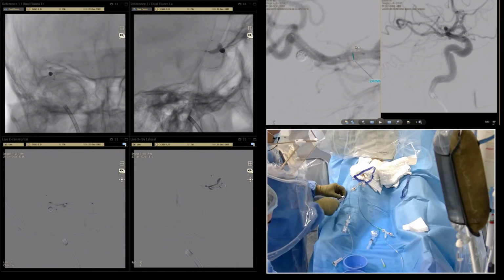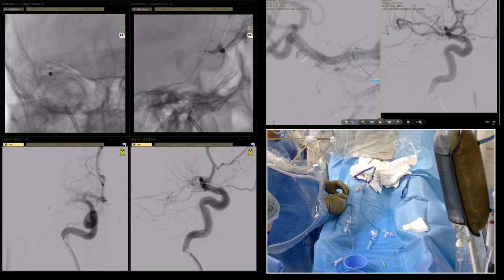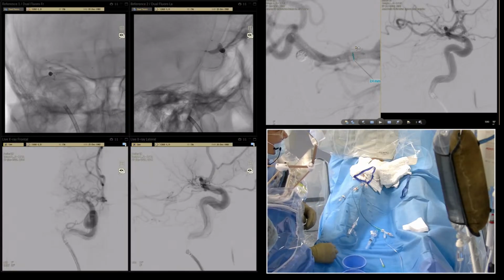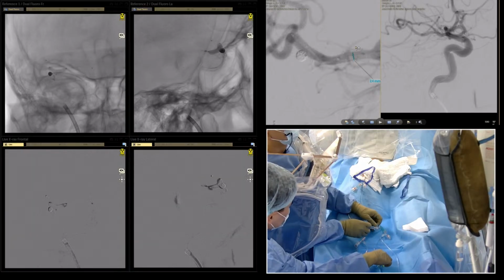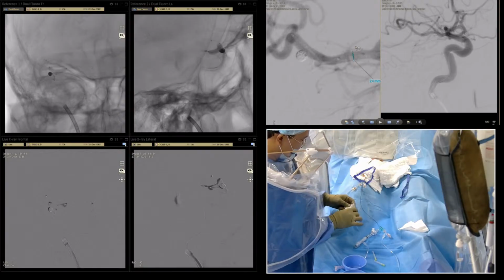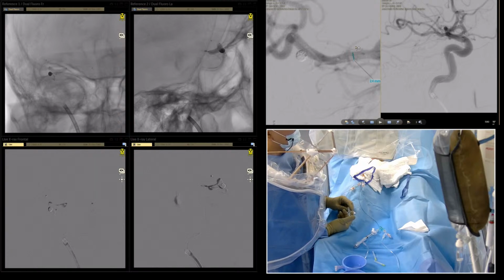I'm really scared to do angiography from the microcatheter. We can enlarge the hole. Okay, it's just at the point of bleeding. Okay, let's inject the liquid embolic. Here. I will inflate a little bit bigger. Okay, 1 second. Yes, it's in the subarachnoid space.